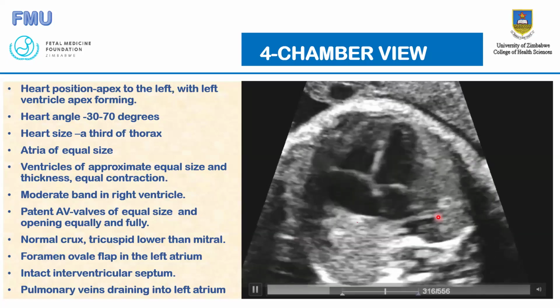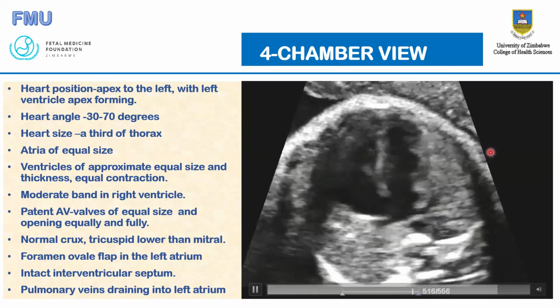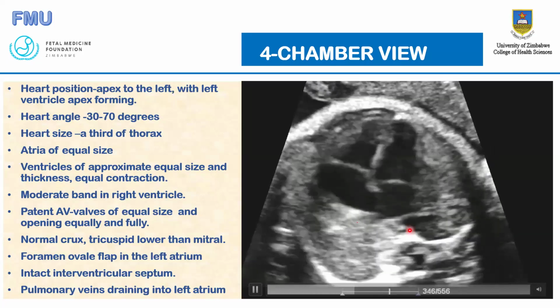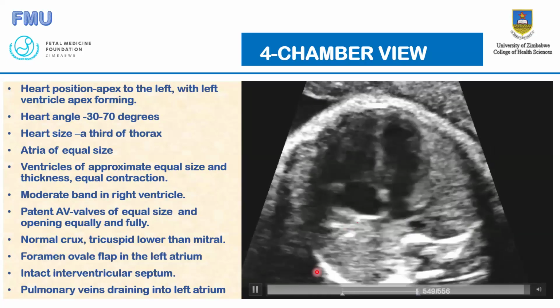This is the left lung and the right lung. The left lung will always appear smaller, and by the way, the left lung is bilobed, because of the heart position, which is squashing it there, while the right lung is trilobed in terms of size.